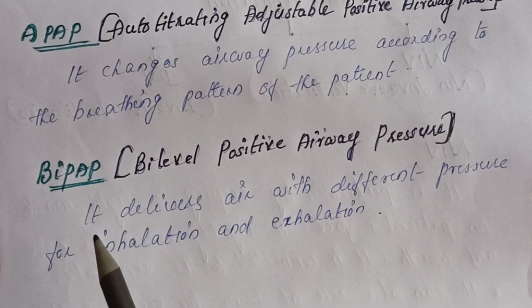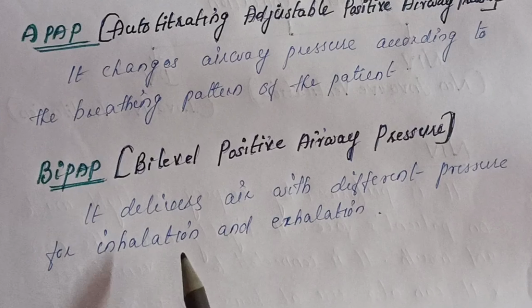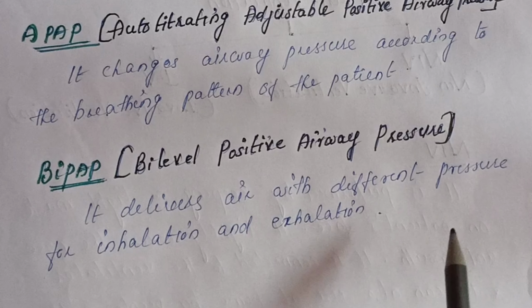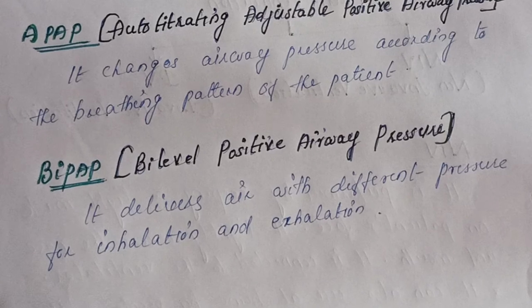The last one is BiPAP, that is bilevel positive airway pressure. It delivers air with different pressure for inhalation and exhalation. In BiPAP, we can set different pressures for inhalation and exhalation.